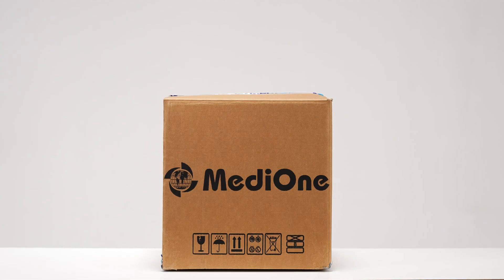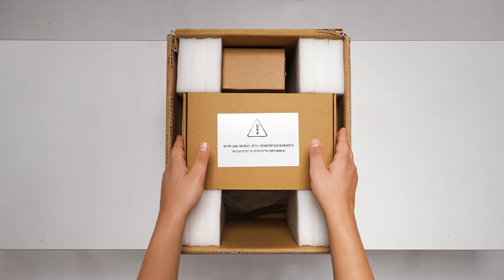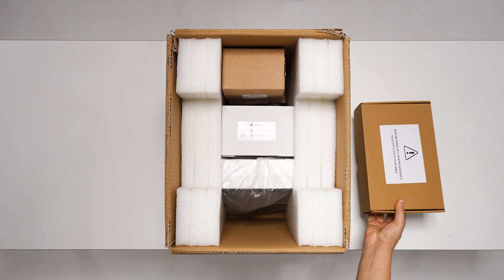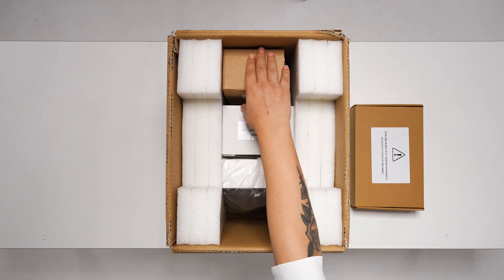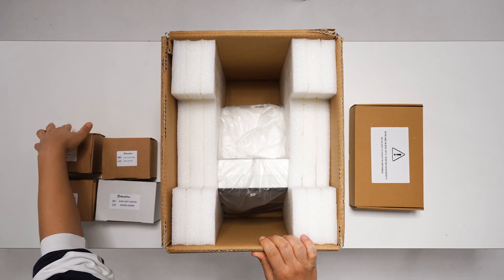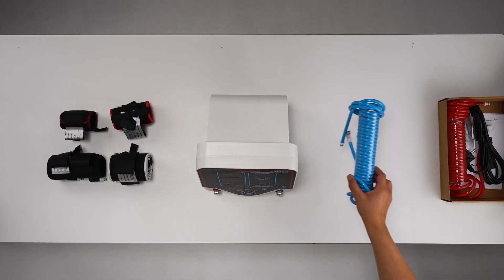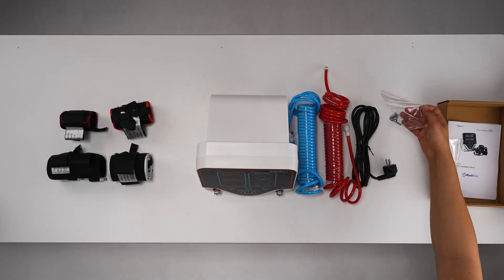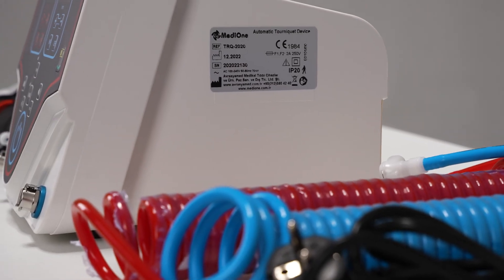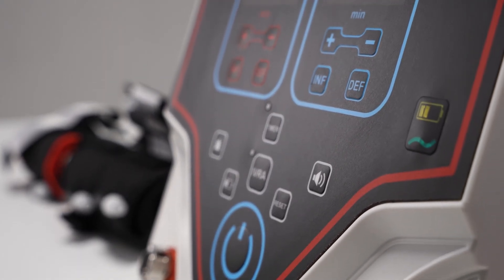This is how the product looks when it reaches you. Now let's take a look at the contents of the box. When the device reaches you, there are five boxes in it. One of them contains auxiliary equipment. The other four boxes contain the cuffs. First, we remove the cuff boxes, then we remove the auxiliary equipment box. There are two fuses, two hoses, one power cable, and the user manual in the auxiliary equipment box.